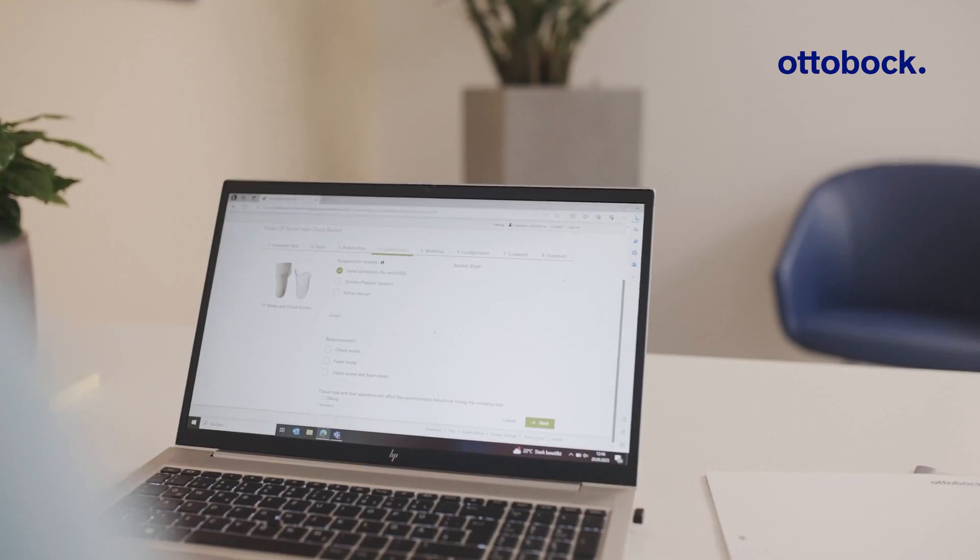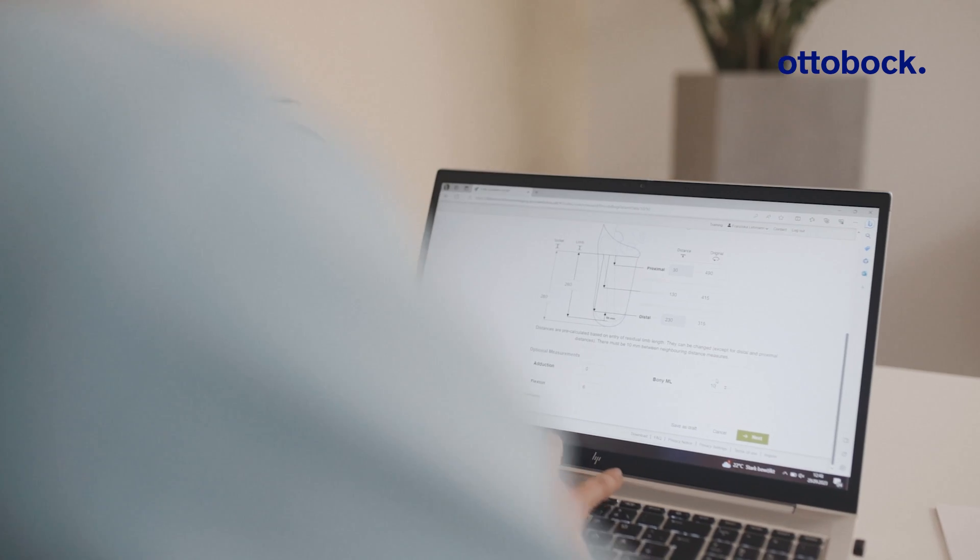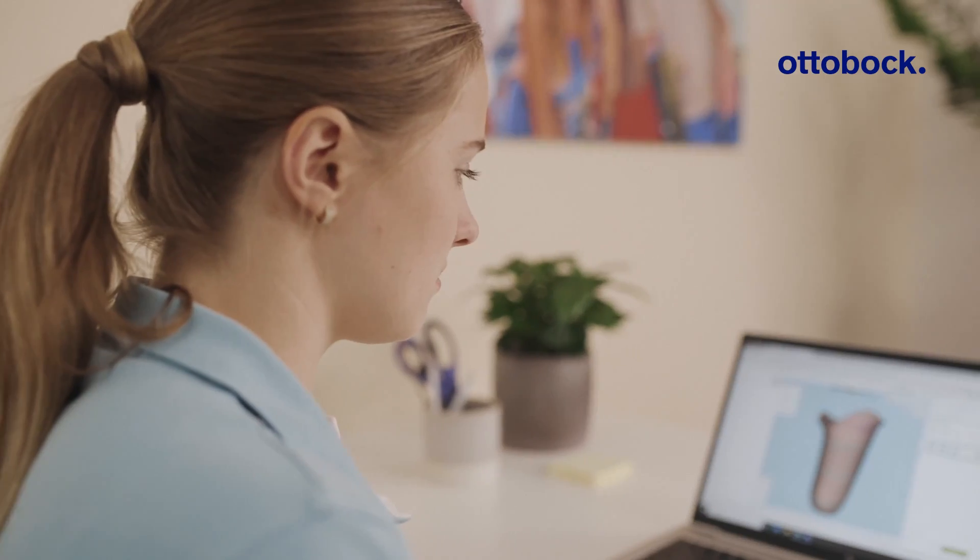What's new about MyFitTF is the platform. It's no longer on a local software where you type it in, but it's all online now — on the ICC.